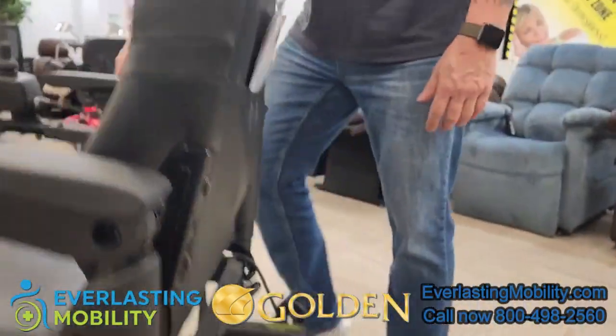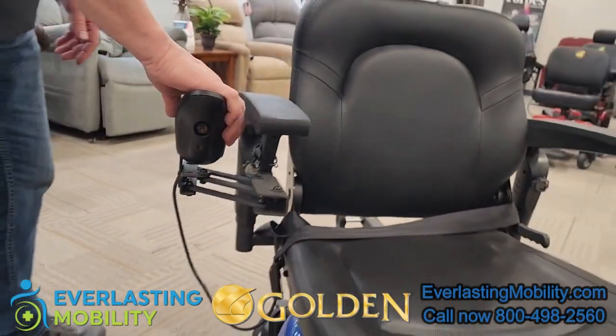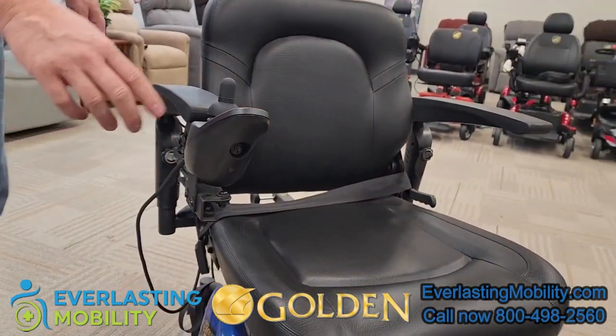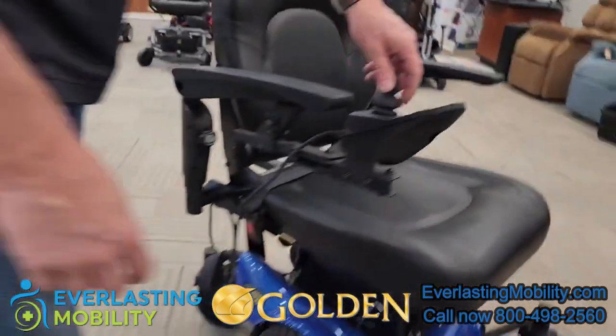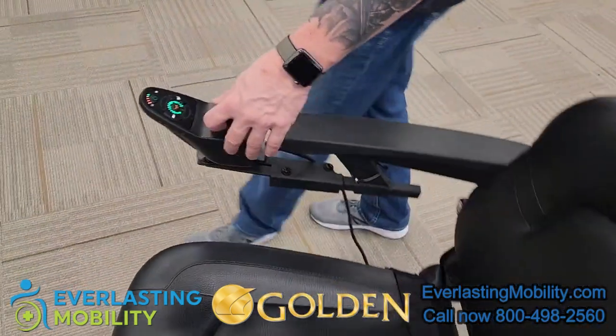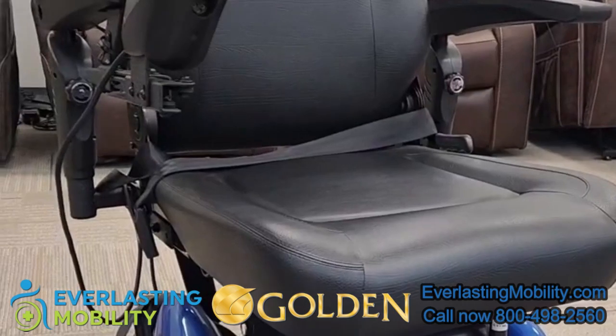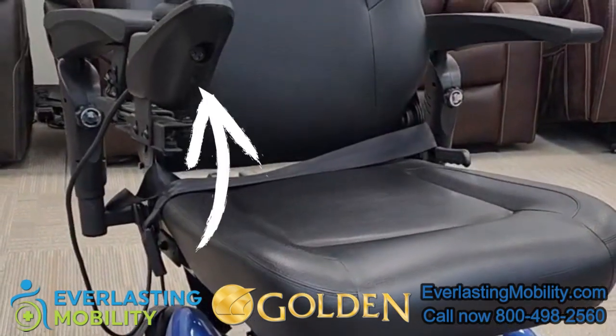The joystick does swing to the side so it's easy to get in and out of the chair and you don't have to worry about the joystick being damaged. Also, to charge the chair, you would charge it at the joystick — you don't have to bend down; just plug it in right on the joystick.